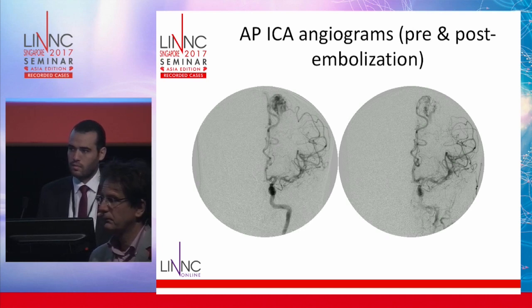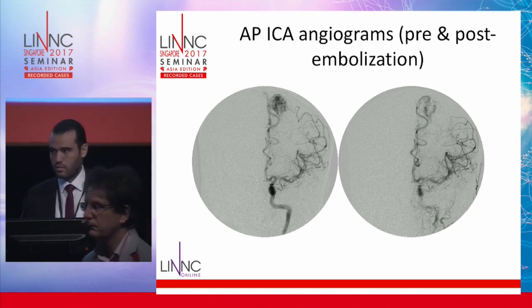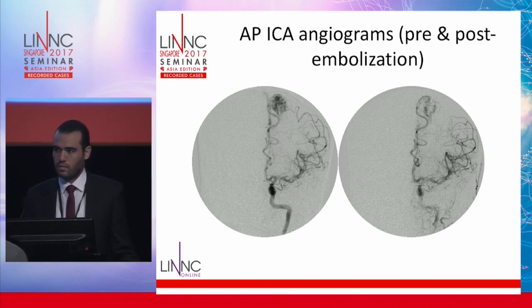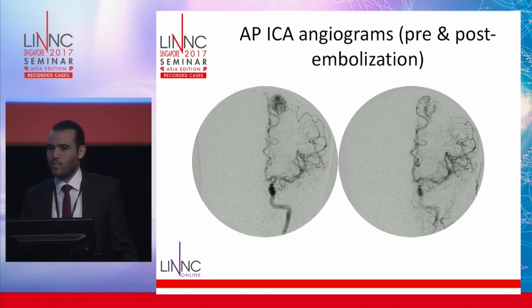But you know, he started with the intention to do a first session, followed by the second session after a few weeks. And he had in the middle something that he didn't control, which was a progressive occlusion of the venous system. Of course, you are not always controlling everything. So probably this is what has happened to him. Of course, this AVM can be managed surgically from the start without embolization, but this was our decision.